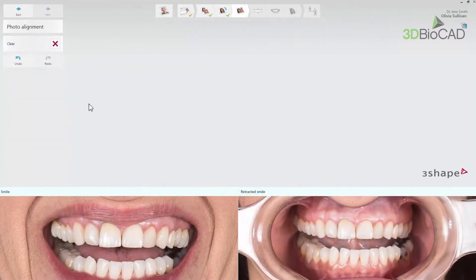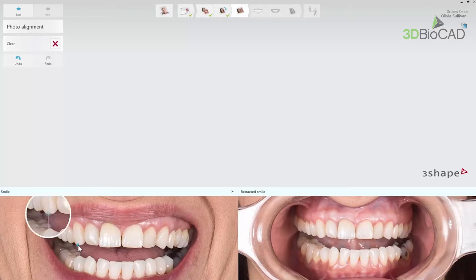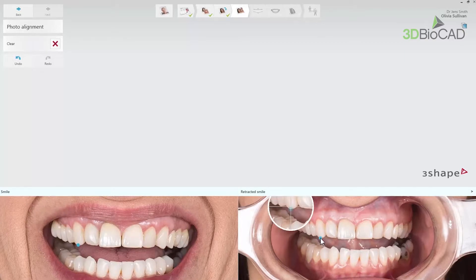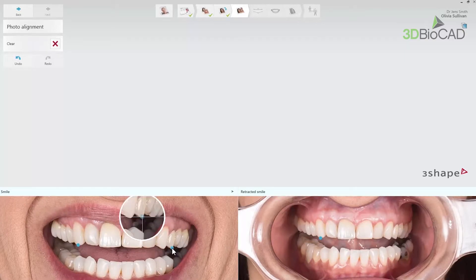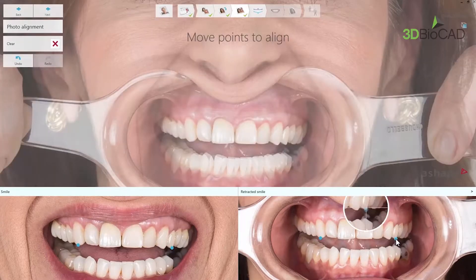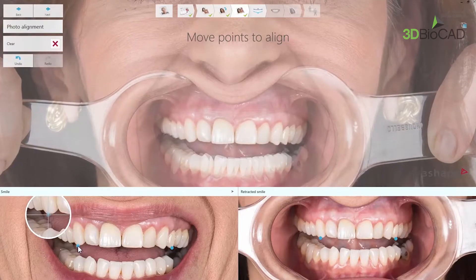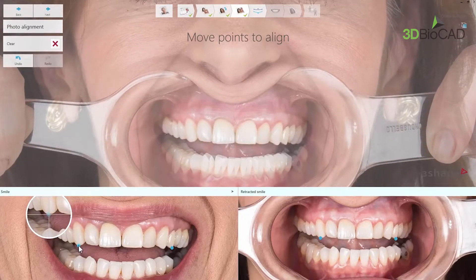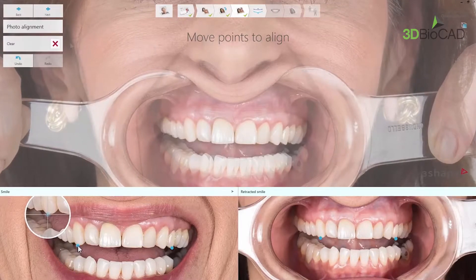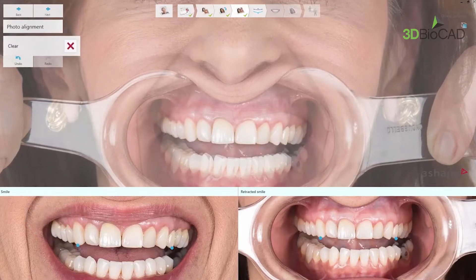When ready, click Next and perform alignment of the two photos. If you only work with a smile photo, you'll go directly to the smile design step. Alignment should be done by placing two sets of corresponding points on the pictures. The magnifier glass tool is also available here. As a result of the alignment, you will have overlaid pictures with aligned teeth and the possibility of further adjustment. The clear button is available if you'd like to start the alignment again.